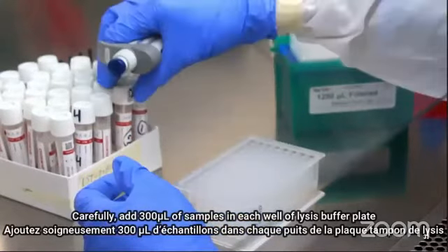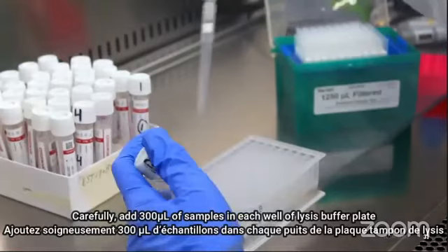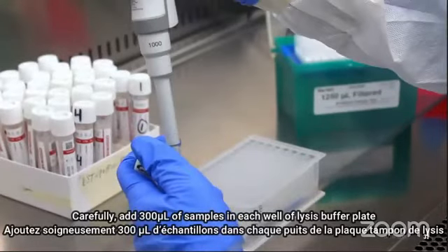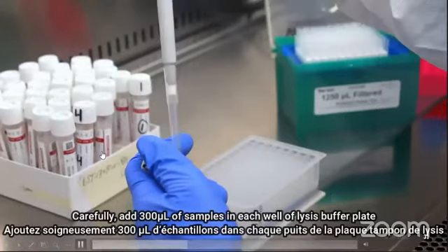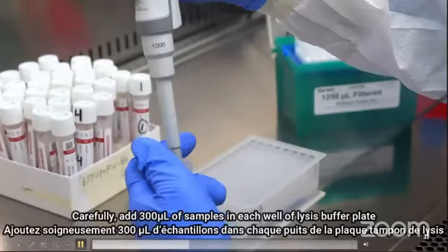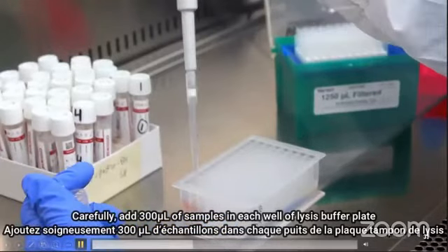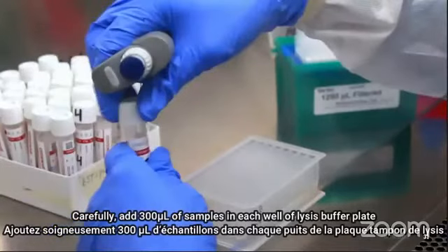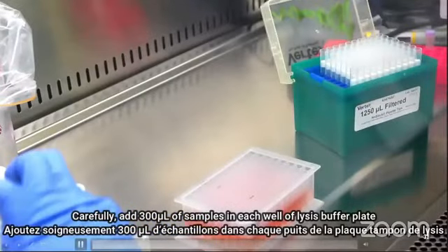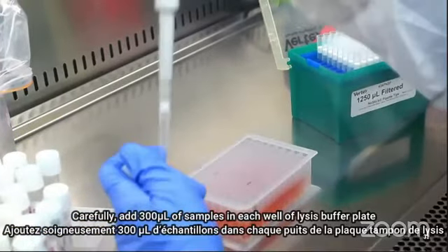Now the sample number 2. This is the identification code of the patient sample. Now this deep well plate is completely filled with different types of the samples.